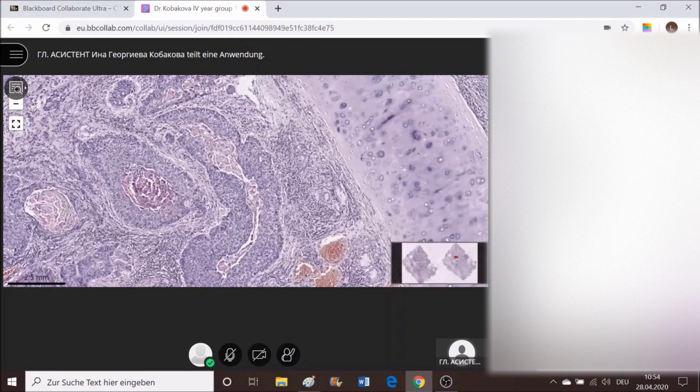That's weird. I see it clearly. How are the others? Maybe you should wait for some time up to when it becomes more clear, or if you want to, open them from the additional materials so that you would be able to observe it better and find the exact field.